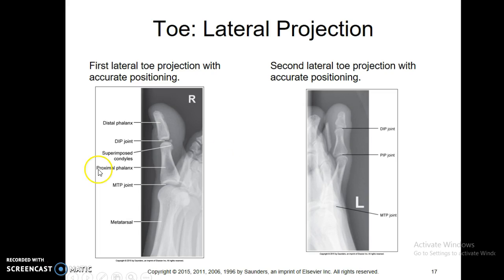And you can send more than one lateral image. If you bring the toe back and that works pretty well or it doesn't work very well, you can put the toes the opposite direction and pull this toe down. So you have to use a little bit of critical thinking on there and say, well, have I shown as much detail as I need to see on this?